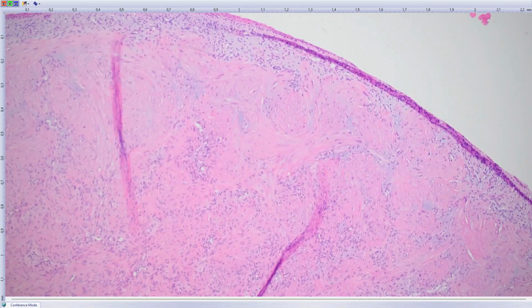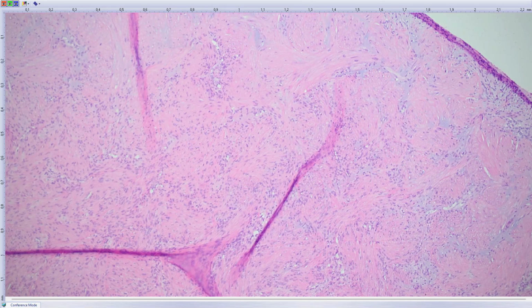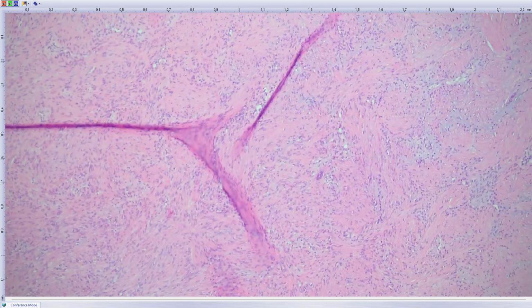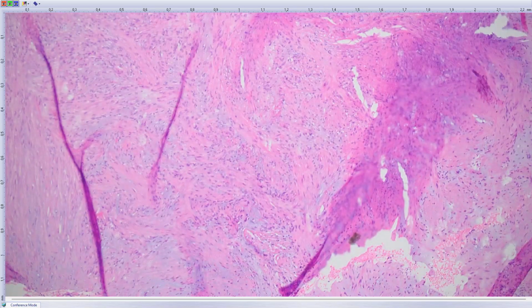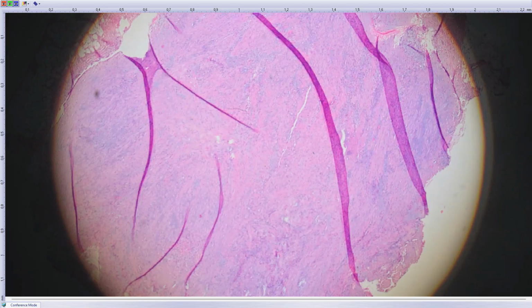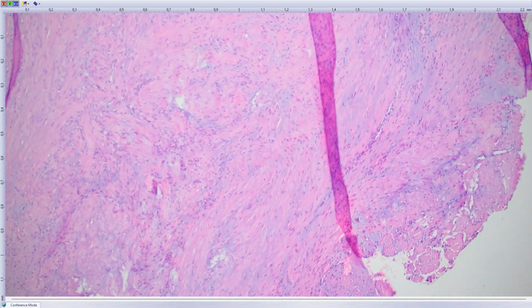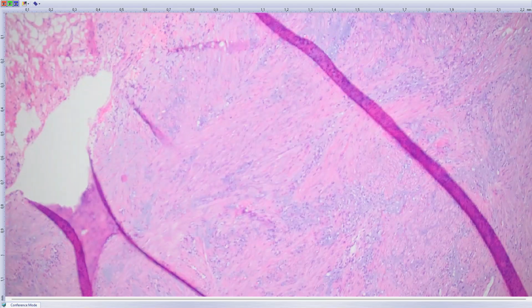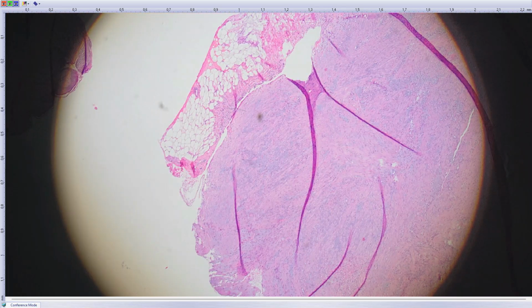So this is the first one, where you see this myoid appearance. It looks like some smooth muscle neoplasm in the center. You see these bundles of smooth muscle-looking cells with prominent eosinophilic cytoplasm, no prominent atypia, nothing. I will show you the other slide. So this is the next lesion, very similar. Again, a smooth muscle-like neoplasm.